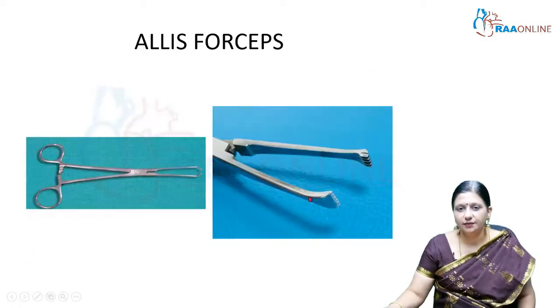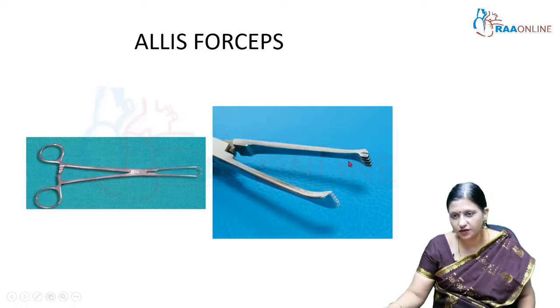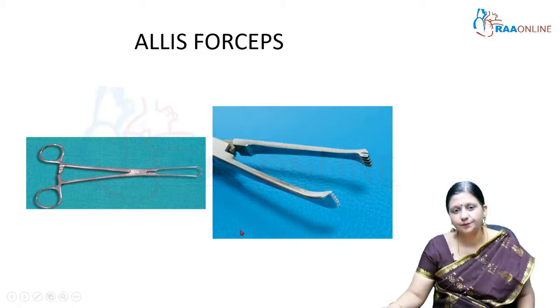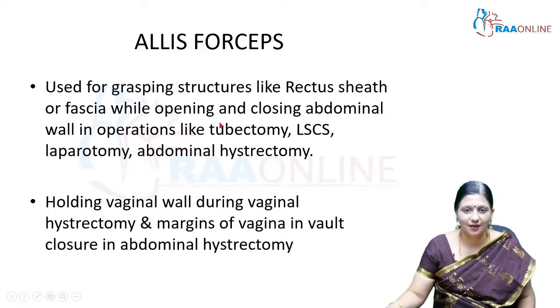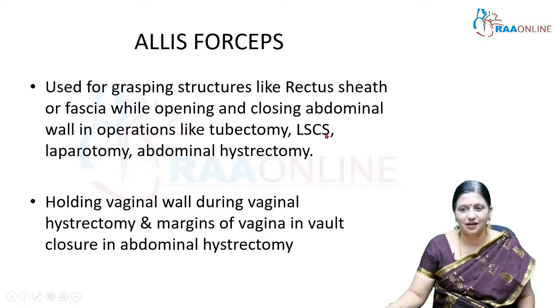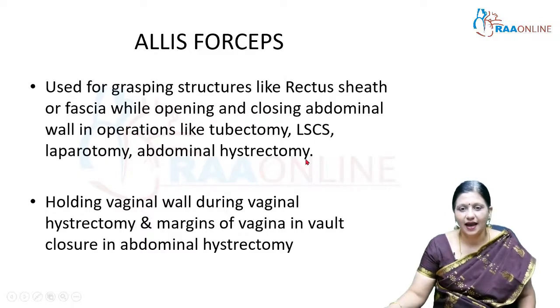The next instrument is the Allis forceps, identified by its multiple teeth. It is a traumatic instrument with a latch, and is used for grasping structures like the rectus sheath or fascia while opening and closing the abdominal wall in surgeries like tubectomy, lower segment caesarean section, laparotomy, and abdominal hysterectomy.